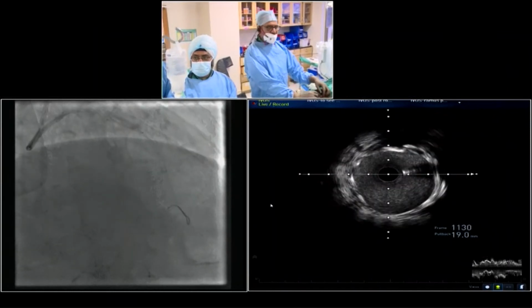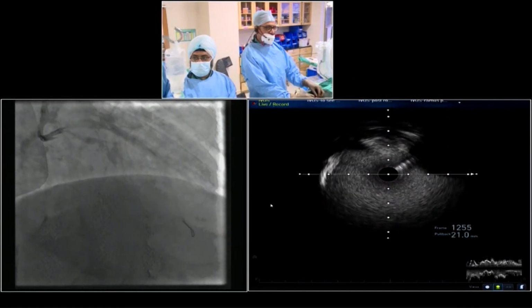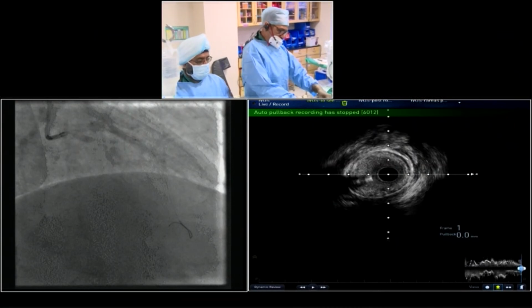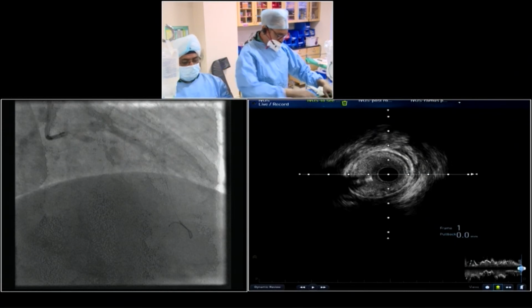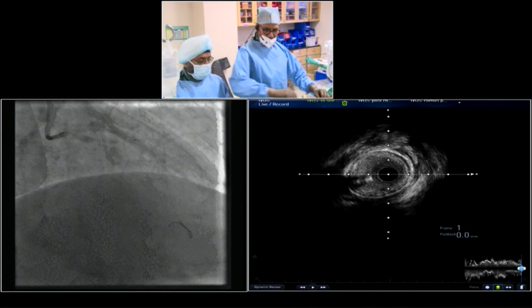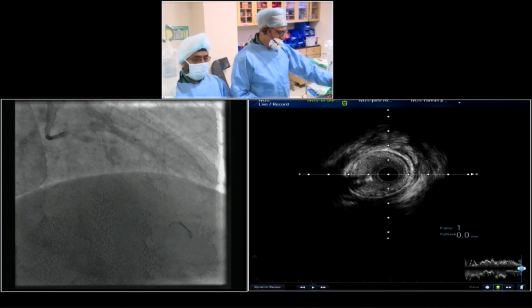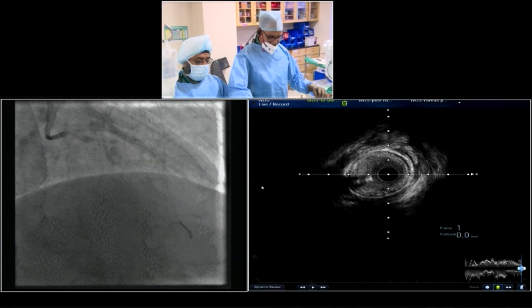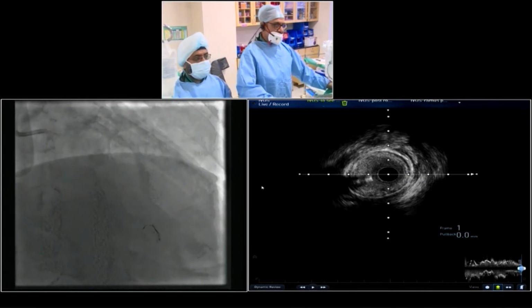Perfect position. So Srinivas, I have a question for you. Every single one of the cases live has had some imaging used. Is this standard or is this just for transmission? Oh, no, it's not like that. For left main, I think we should appreciate that a significant number of centers are using imaging, but not for all other vessels. For complex cases, left main more commonly, everybody used imaging. I would say it is positively increasing, but maybe 20%.